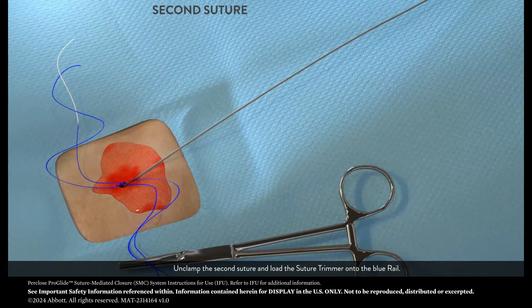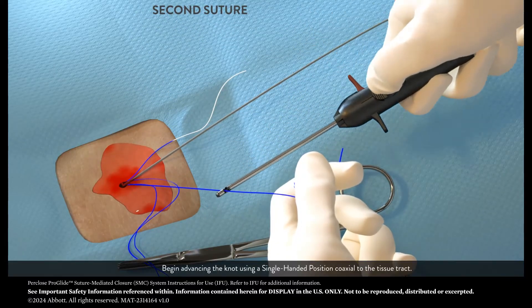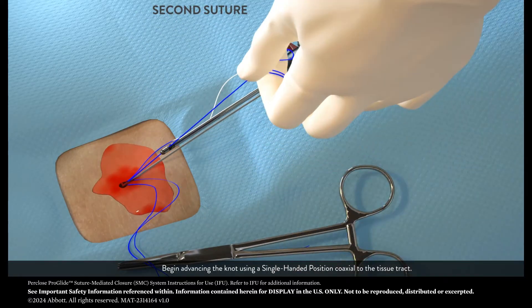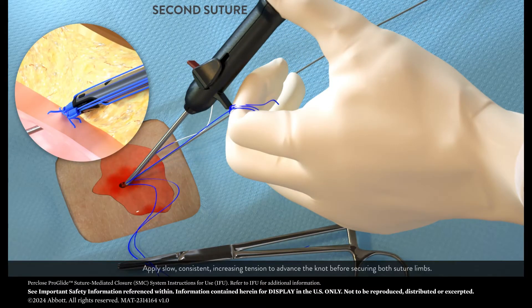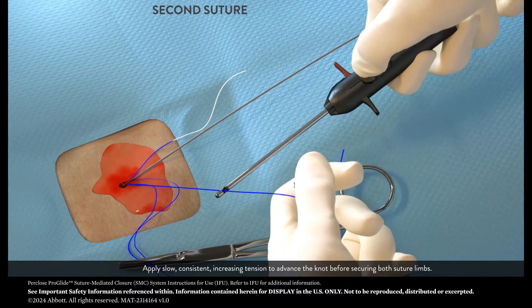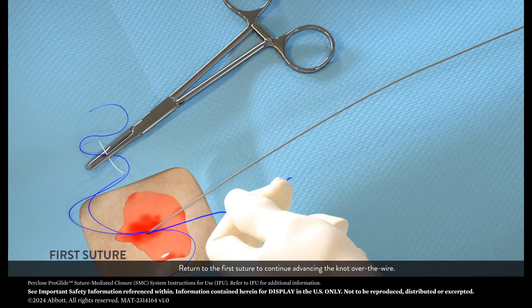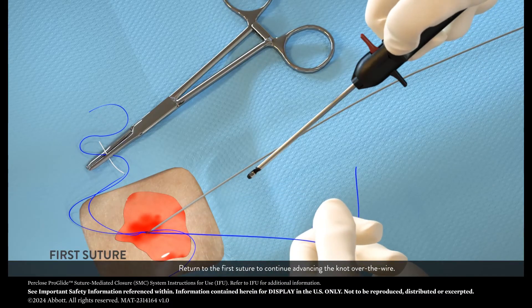Unclamp the second suture and load the suture trimmer onto the blue rail. Begin advancing the knot using a single-handed position, coaxial to the tissue tract. Apply slow, consistent, increasing tension to advance the knot before securing both suture limbs. Return to the first suture to continue advancing the knot over the wire.